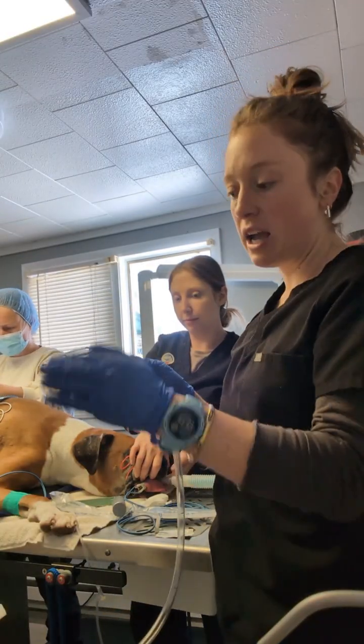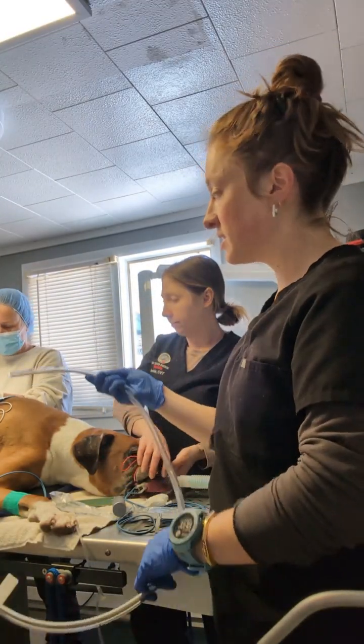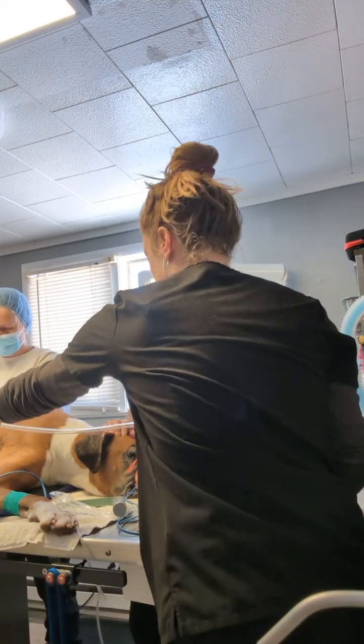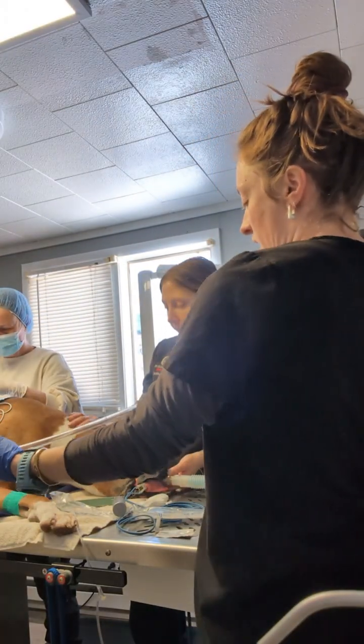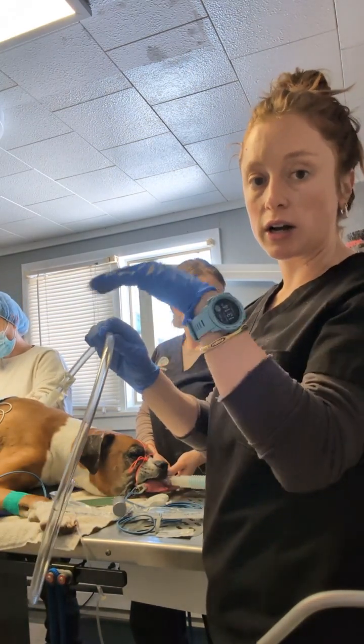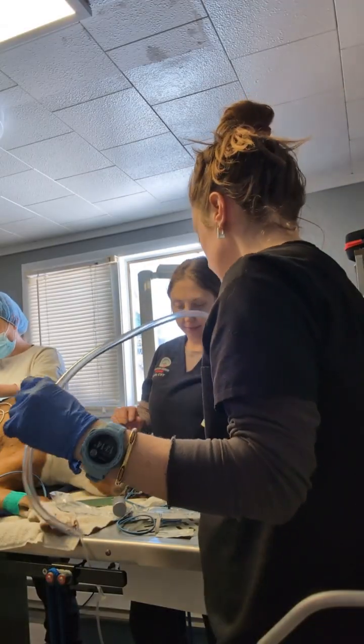I want to place it the same, put lube on the end and pass it, but I just want to measure it all the way back to the stomach. So then I would place it the same, insert it into the stomach, and then ideally secure it just to make sure that they're not going to bite down or swallow it.